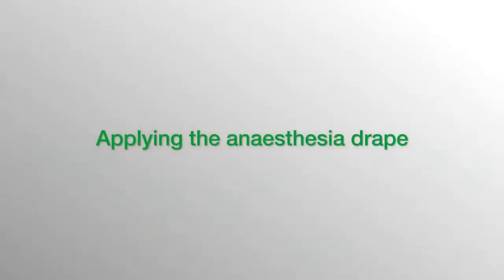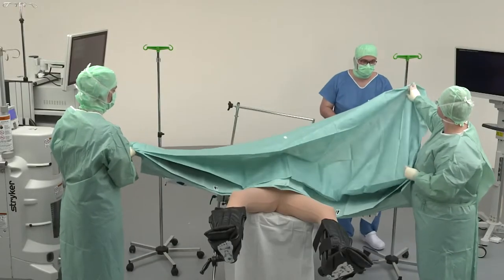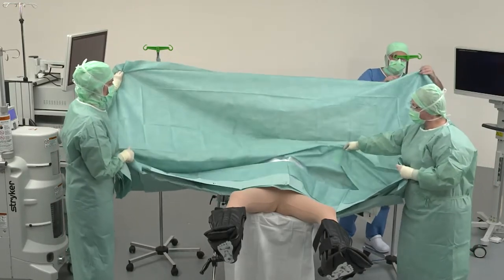In the second step, the drape is unfolded in the direction of the anesthesia team and handed over to them. Here, too, the arrows show the direction.